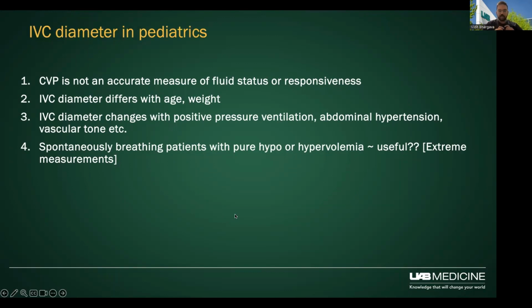So having reviewed where this intent of using IVC diameter came about, looking at some of the pictures, understanding a little bit, I want to explore some more into why IVC diameter in pediatrics is not useful. I think the first thing that we have to think about is that it relies on the concept of using CVP as an accurate measurement of fluid status or responsiveness.